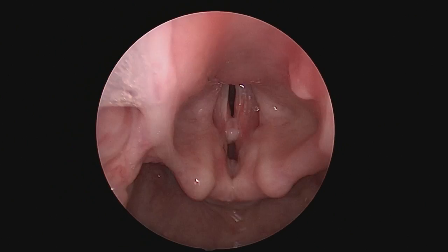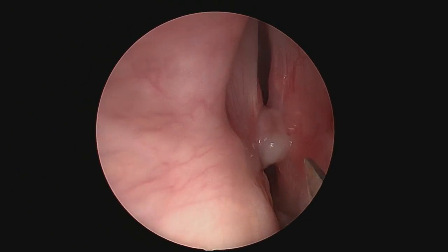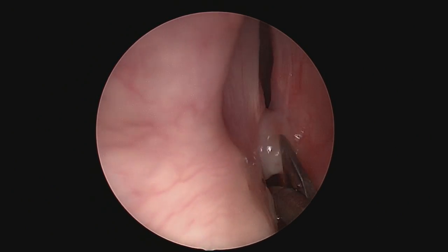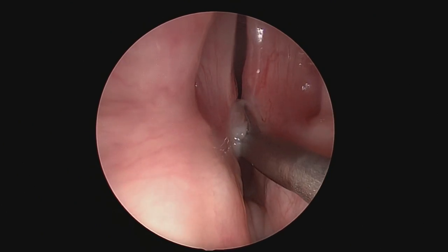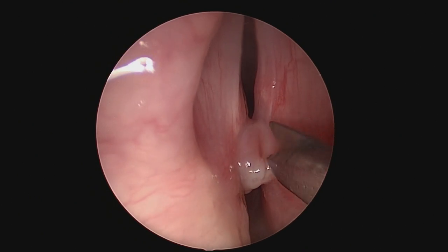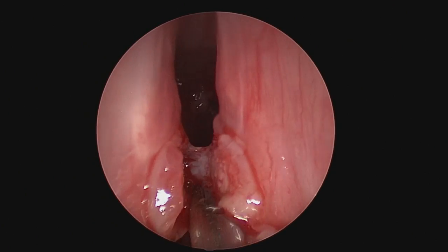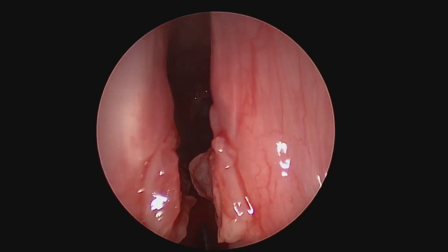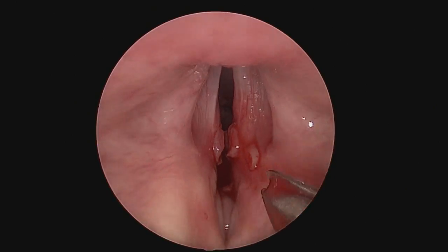So she came in in distress, and I took her to the operating room. After I made my diagnosis, I put her in suspension and used some scissors to cut the laryngeal stenosis. It's a pretty thick scar, so I was able to eventually cut through. I felt this was better than just ripping it with cup forceps or dilation, since it's so close to the vocal cords.